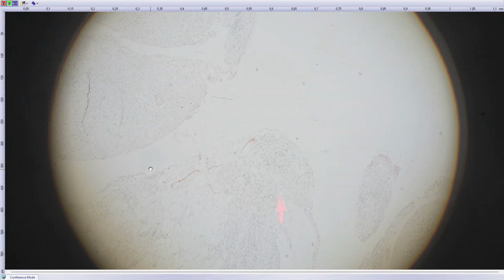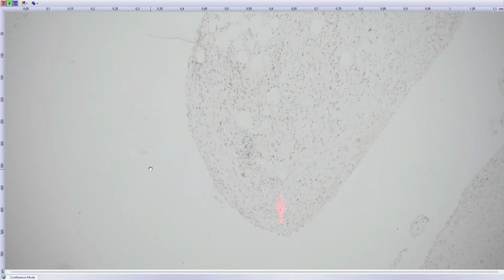And you can also use another marker which is supposed to be pretty specific for Rosai-Dorfman, and that is OCT2, which should show nuclear expression. This is the best one. Usually Rosai-Dorfman is a localized disease in one lymph node or a few lymph nodes or in the skin, and the patients will be okay. But this guy had a diffuse process.